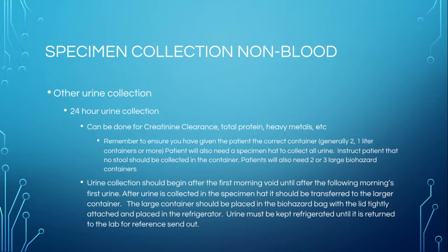And then it may be from 7:30 or maybe from 9 a.m. to 7:30 a.m. the following morning, but you want them to put the time they started till the time they stop. There are some specimens that it doesn't matter. They just need 24 hours' worth. You will always be able to look in your reference book for your reference lab. There'll be a book that tells you the lab test number to put on the requisition, what kind of containers you need, and all the information related to that test.